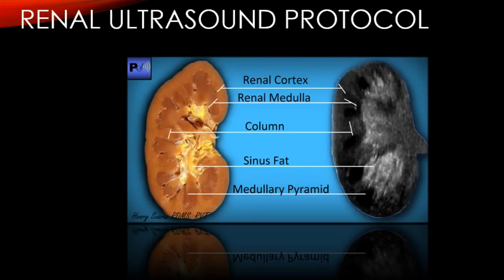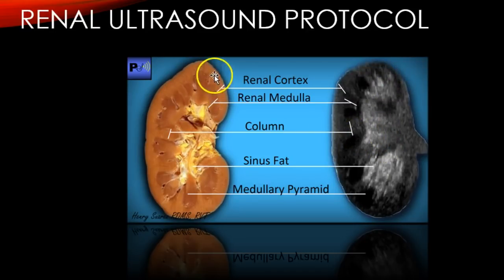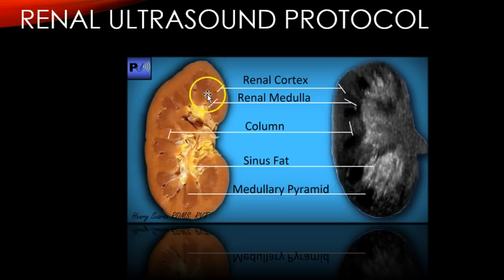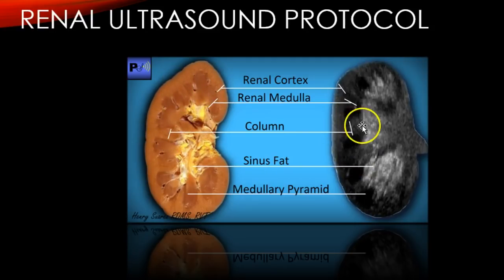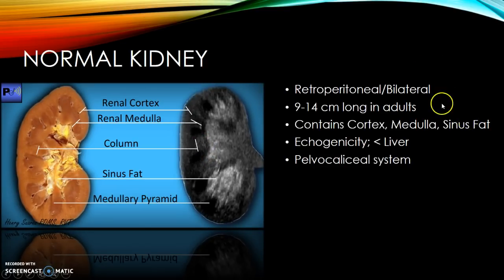Today I'm going to go over a renal ultrasound protocol and some basics. Here's a sagittal cross-section of the kidney showing gross anatomy and the ultrasound appearance. You can see the renal cortex all around it, the renal medulla or medullary pyramids which are hypoechoic, the cortex with medium-level echoes, and the echogenic renal sinus fat.